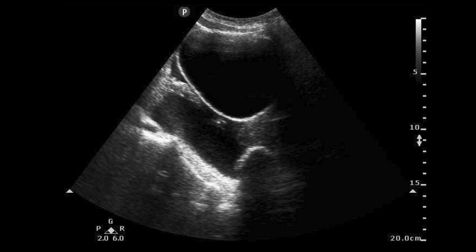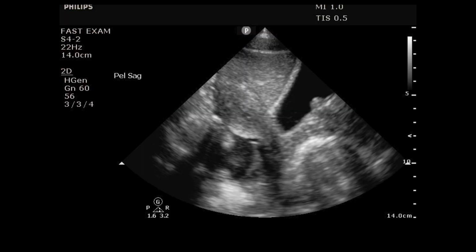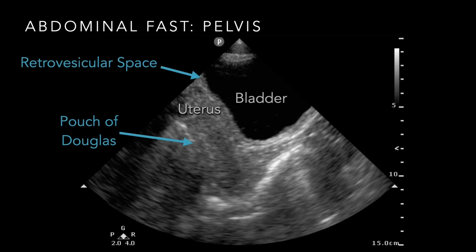in the intraperitoneal space on the left side of this screen. So here's an example of a positive pelvic window where you can see that free fluid that's outlining the bladder here. And in this example, it's a little less visible, but you can see free fluid surrounding the uterus. It's clotted free fluid, anterior or cephalad from the bladder, right? And so it's an example of that.